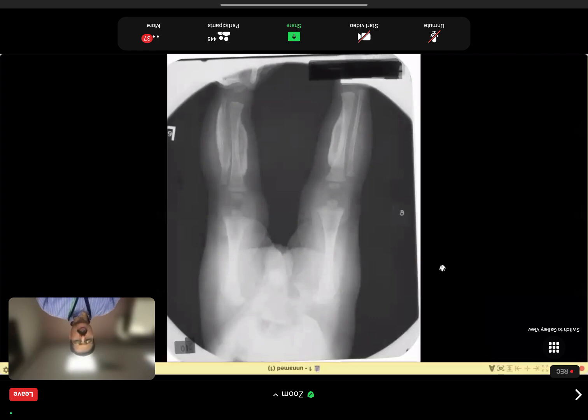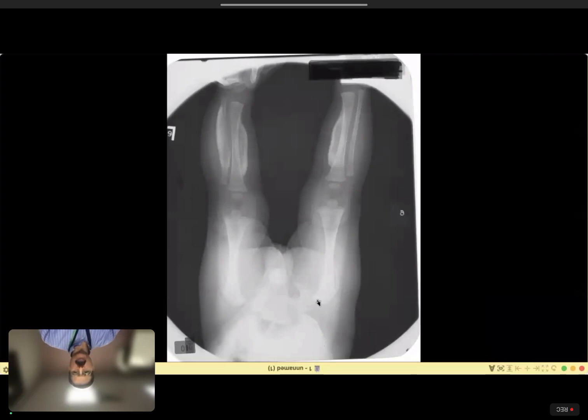So coming back to the case itself, first of all, age. Please remember the age you are going to tell the examiner. You cannot ask the examiner why the femoral head epiphysis is not visible. What is the normal age of appearance? In girls, it is 2 to 6 months, slightly early. So 6 months is a good point to remember. In boys, it is 3 to 7 months, but there might be a subtle discrepancy in various sources. So generally speaking, even in boys and girls, it will appear at a maximum of 6 to 7 months.